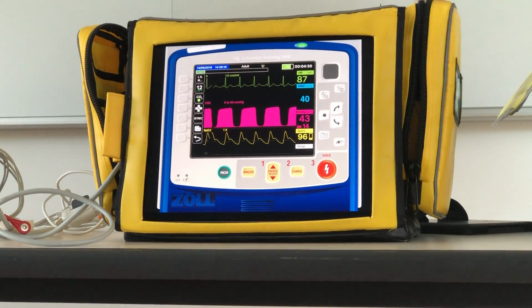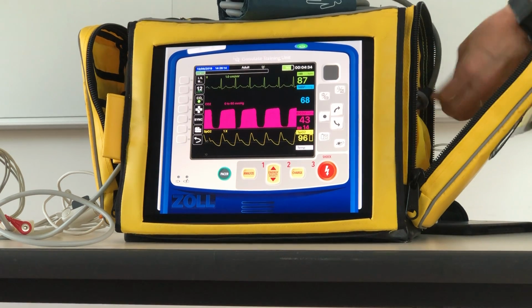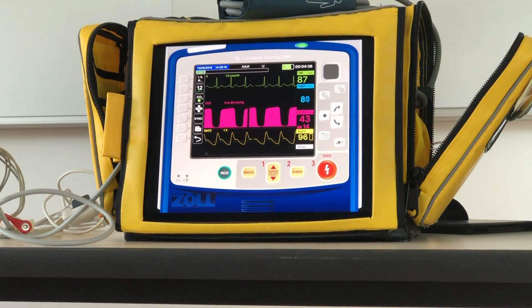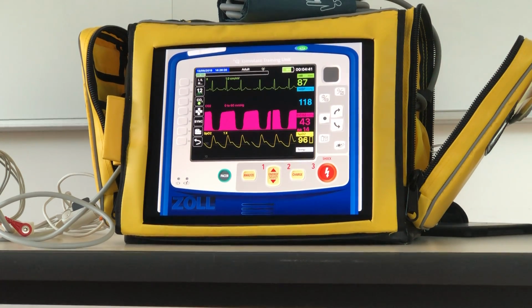The blood pressure cuff is right here on the side. They have to pull it out, they have to hook it up. But of course, it's just a tubing tied to a bag. It's not really going to inflate anything. It's an iPad, so there's no inflation happening. But it makes the right sound. It takes the appropriate amount of time.